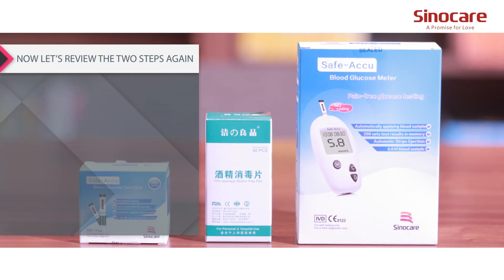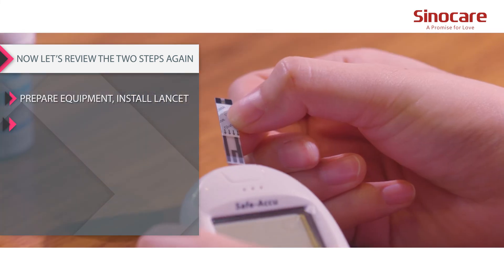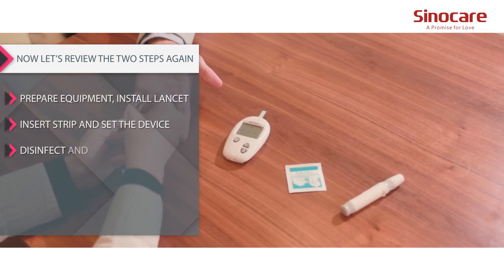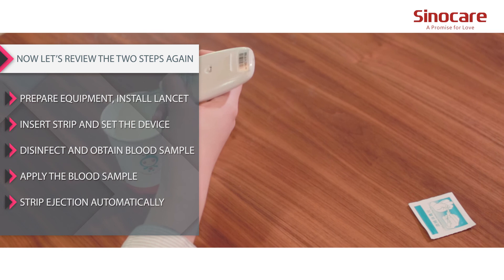Let's review the key steps again: Prepare equipment. Install lancet. Insert strip and set the device. Disinfect and obtain blood sample. Apply the blood sample. Strip ejection is automatic.